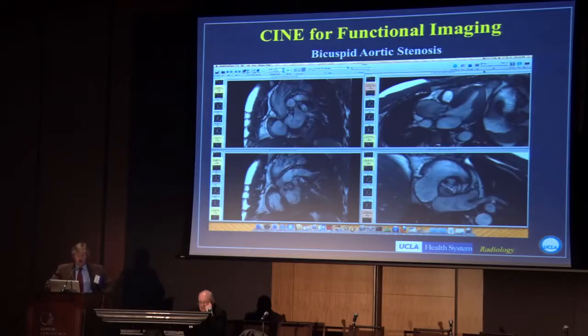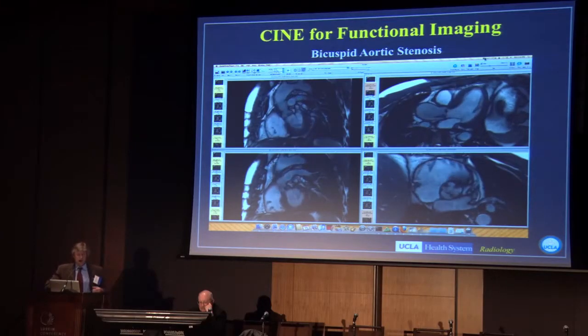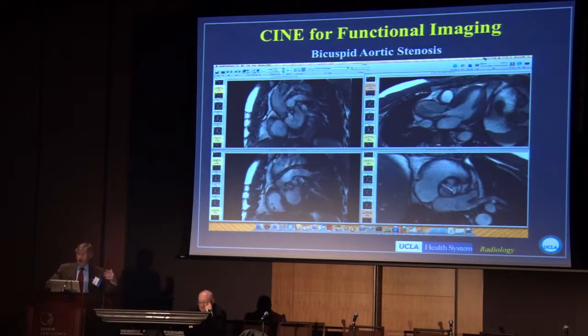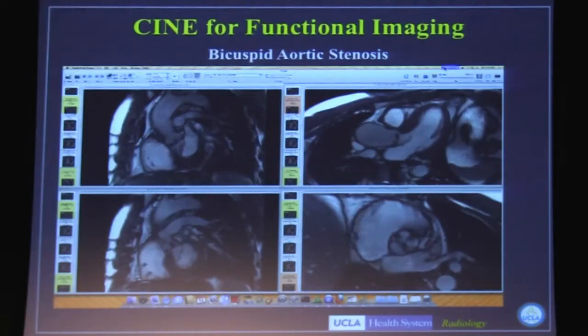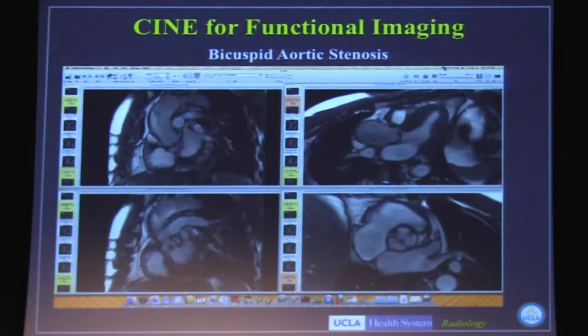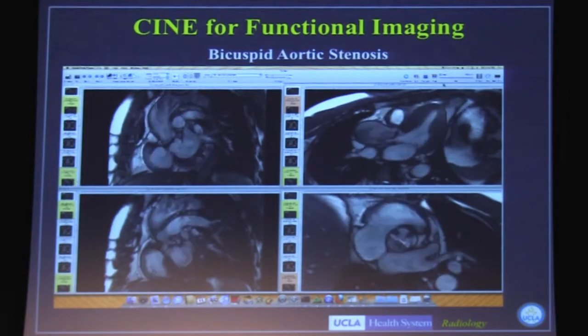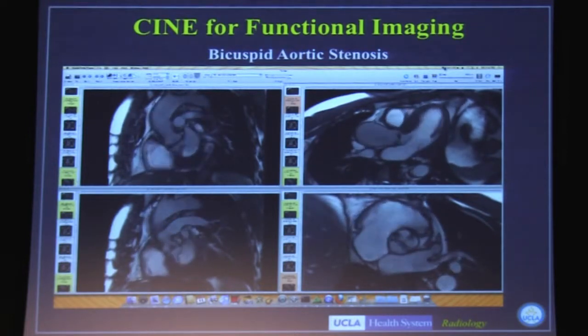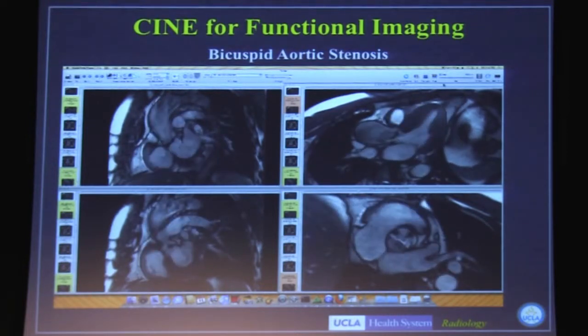Here's another example in somebody with bicuspid aortic stenosis with the same technique. We can see the movement of the valve, the valve thickening, and also the effect on the flow jet.